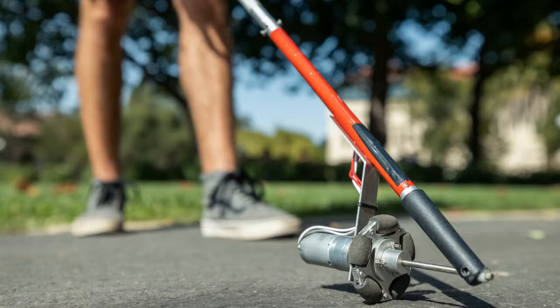It increased the walking speed for participants with impaired vision by roughly 20% over the white cane alone. For sighted people wearing blindfolds, the results were more impressive, increasing their speed by more than a third. An increased walking speed is related to better quality of life, so the hope is that the device could improve the quality of life of its users.